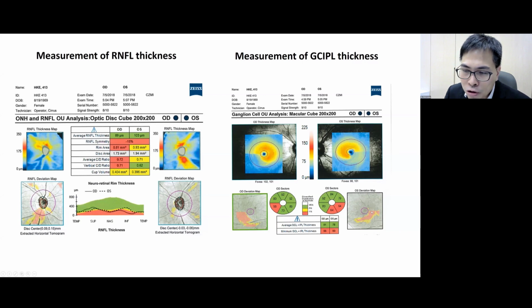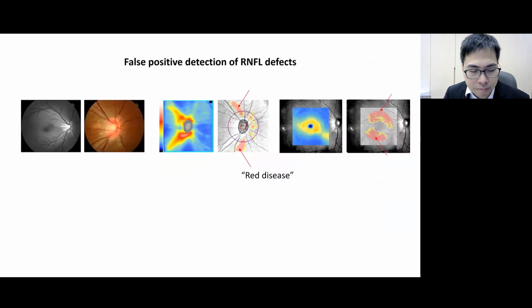So you see bigger damage of the macula. This is the wedge you see over the macula. So when you trace this wedge towards the optic disc, the loss could be so small that it is difficult to detect when you study the rim over the optic disc, and even for the retinal nerve fiber layer, the loss is so little that it is difficult to detect even with OCT. So remember, wide field assessment is critical for evaluation of glaucoma.